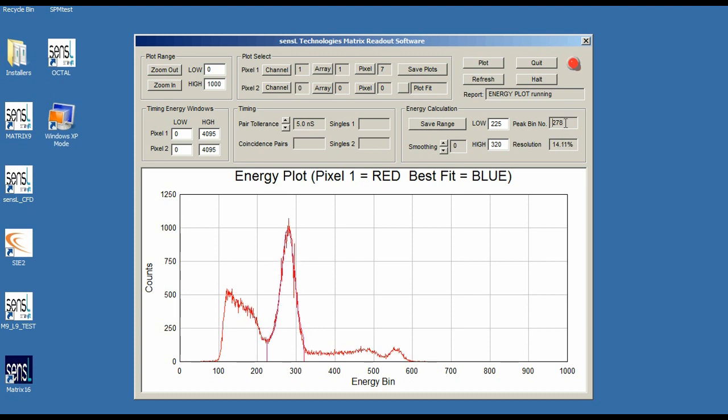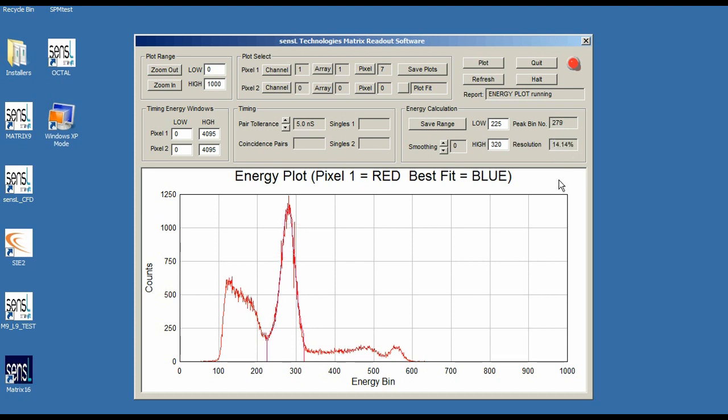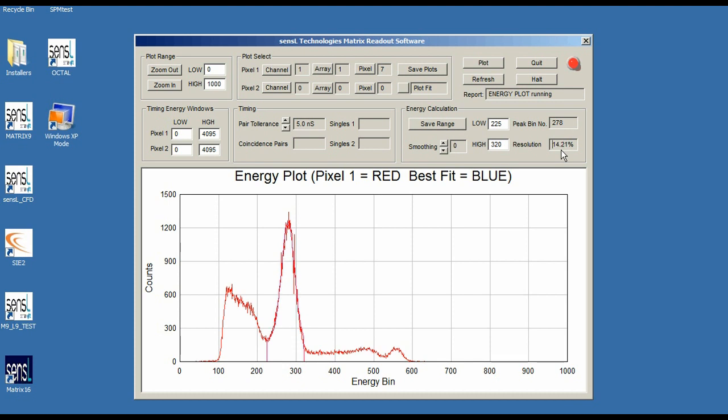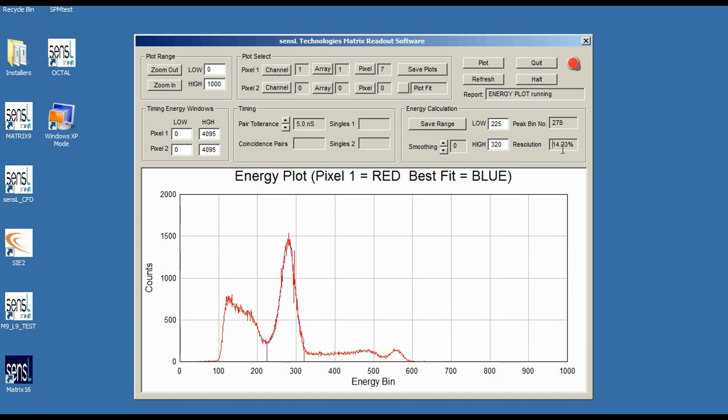Very nice, you can see the energy resolution starting to come out of the plot. It's about, this one in this case is about 14.2%, about 14.2 percent. You can achieve better values than that if you really try to optimize things, but that's a pretty good value to have achieved by having just directly placed the crystal on top of your Matrix SL9 readout head.